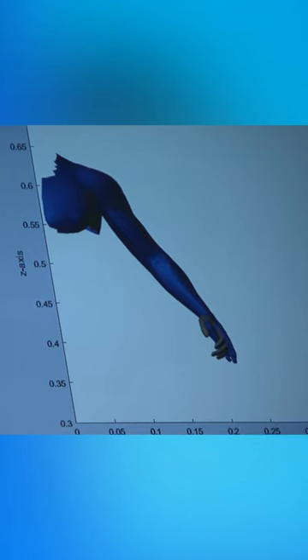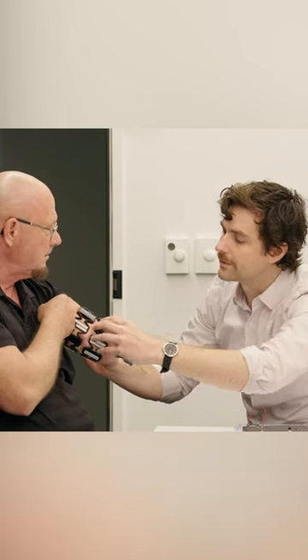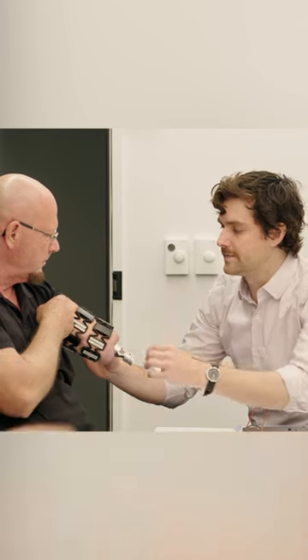So what we can do is connect to those with electromyography sensors, EMG, and we can pick up that activity to send to the prosthesis. Usually what happens is somebody wears an armband over their residual limb.